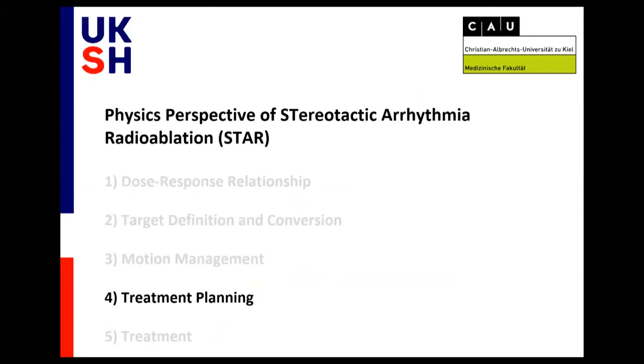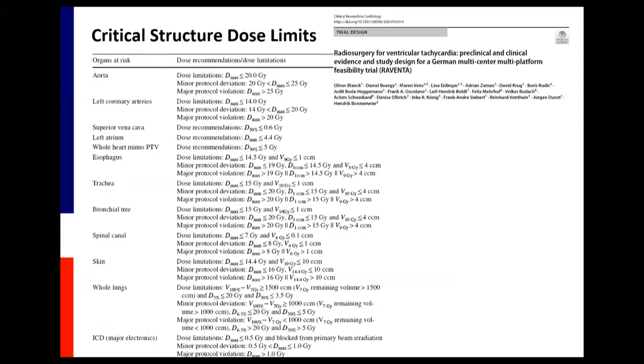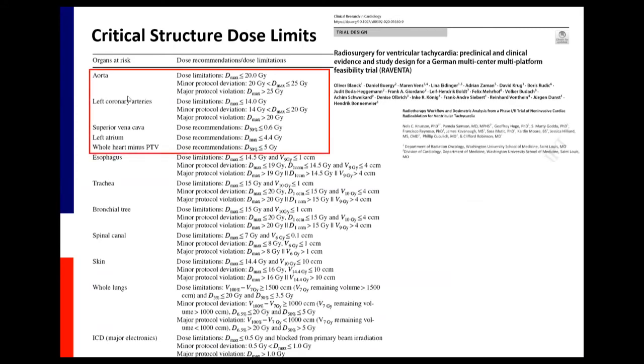So going forward to treatment planning, there's a lot of dose limits that have been published, and also within our Reventa trial, we have published these dose limits. And it took a long time with our authorities also to go over them and to check. And mostly the biggest problem is we don't know about internal cardiac structures or substructures. So we can really only give some dose recommendations. Some limitations for the coronary arteries, which is a bit sketchy. So these are sometimes in the target or near the target. So, you know, there is some variability that we still have to learn on the coronary arteries, what dose we can give. The rest is pretty straightforward, as we know the dose limits there from lung SBRT.